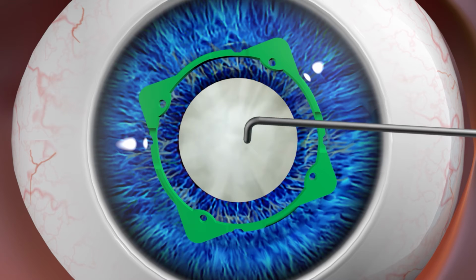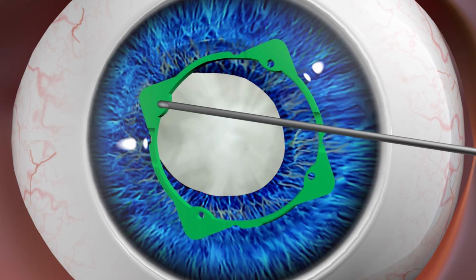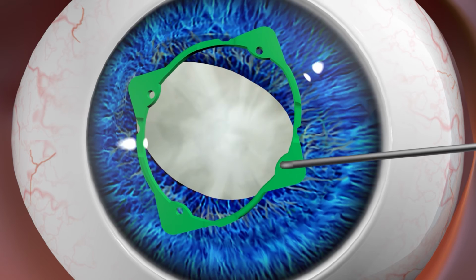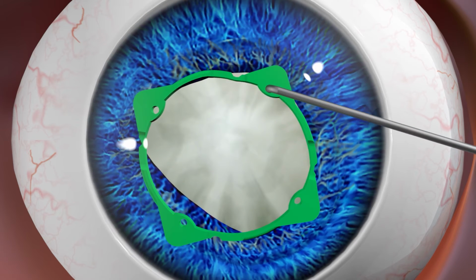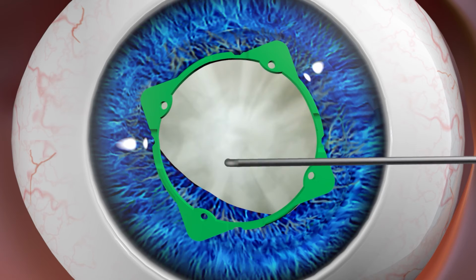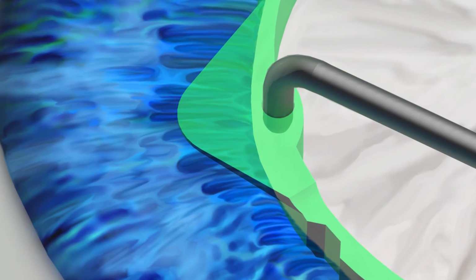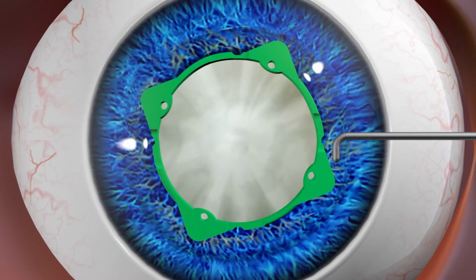Next, engage the four channels of the ring using a Sinsky hook. Secure the distal channel to the iris first, then the proximal channel, followed by the two lateral channels. The positioning holes are isolated from the channel, preventing contact with the iris.